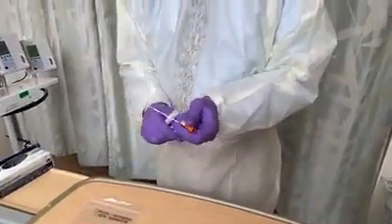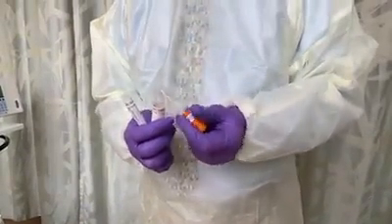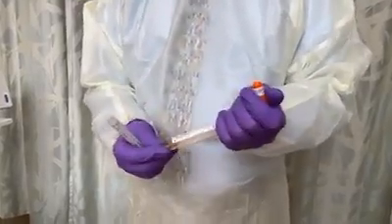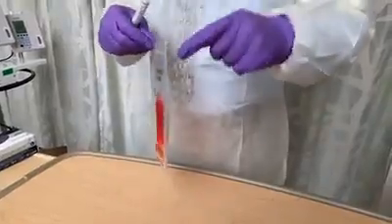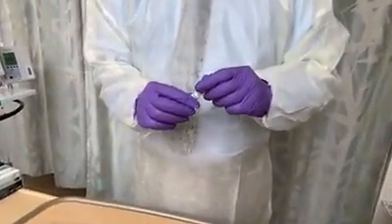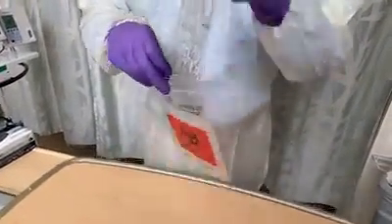Open the collection tube and insert the swab into the tube. Break the swab at the groove. Discard what remains of the swab. Close the labeled collection tube and place it in a biohazard bag. The sample may also be returned to its original packaging for transport, depending on institutional practices.